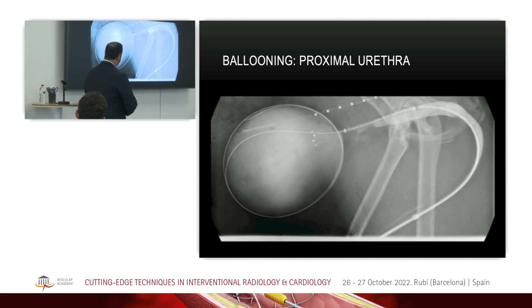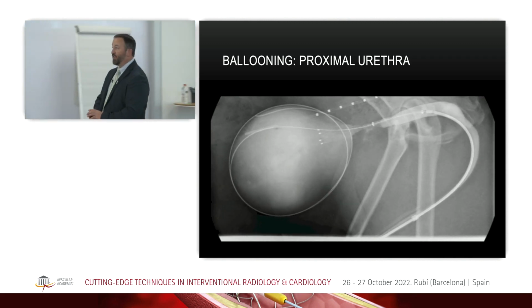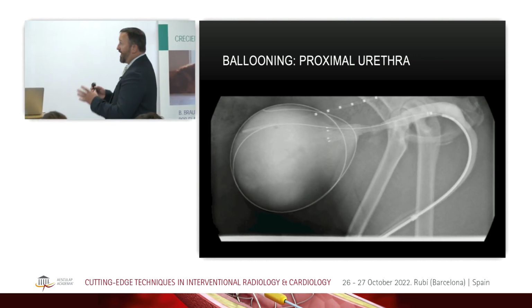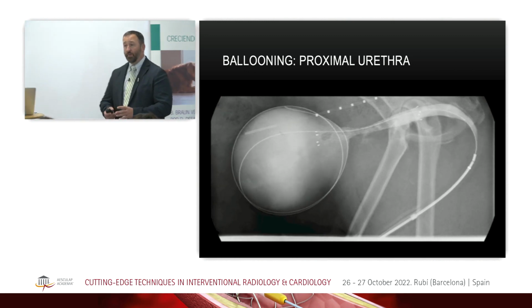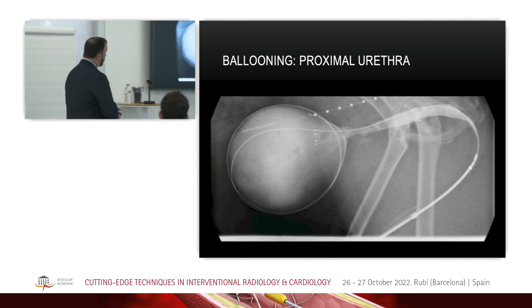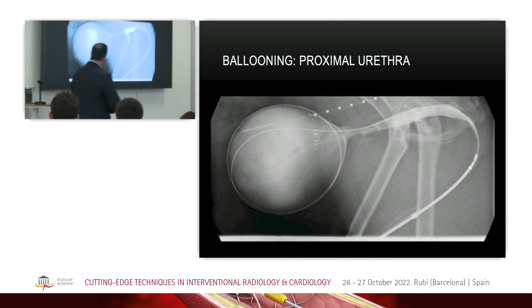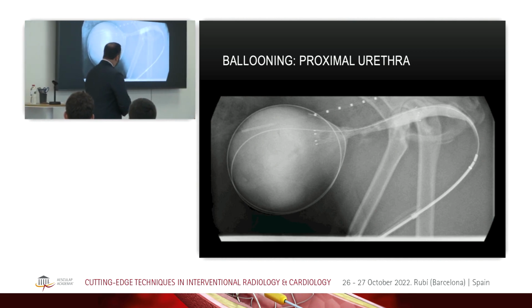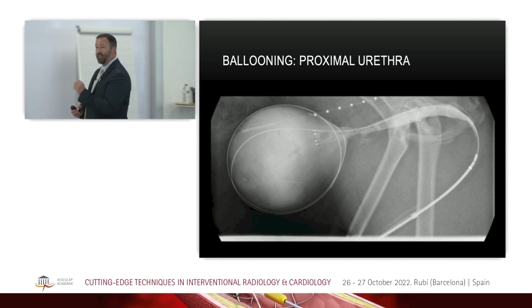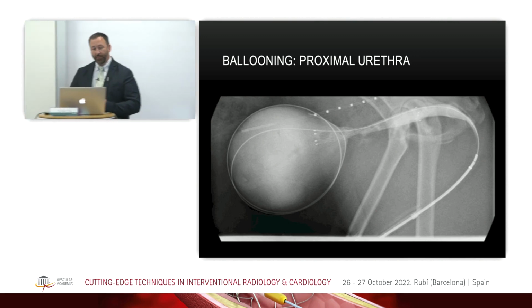And so even though we have a leakage there, just opening the stent is going to be enough to cover over that region that's leaking out. You can see even after the balloon, it's kind of a good news situation, to be honest, how open this stent is. The stent opens to probably about 4 or 5 millimeters in diameter through the stricture, and so that's actually a big win here. That's plenty big for him to urinate through, but probably because it's a stricture, we go back in there, you could place a balloon then, again, inside the stent and then open it up further in that scenario so that you try to maximally dilate it all at the first time.